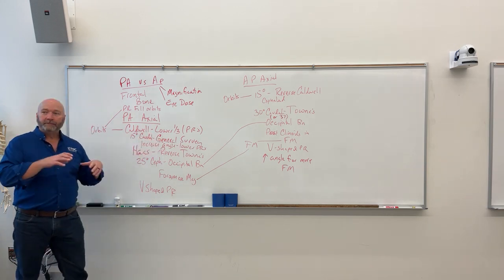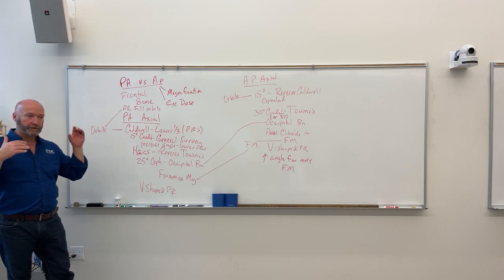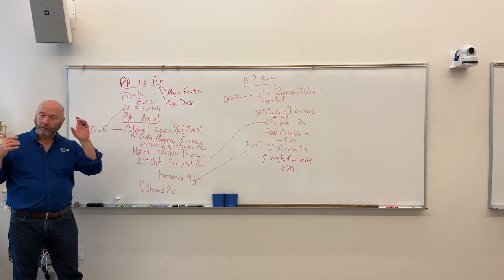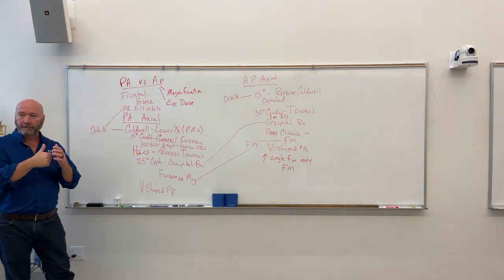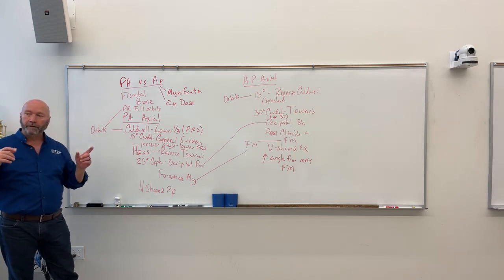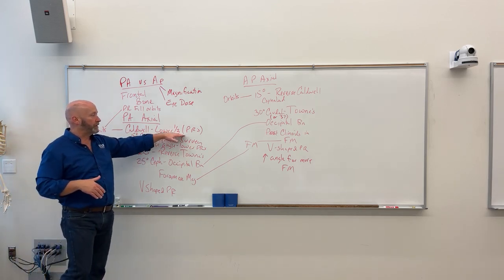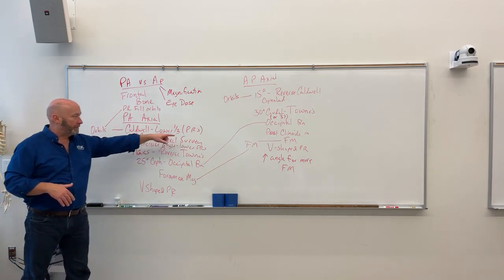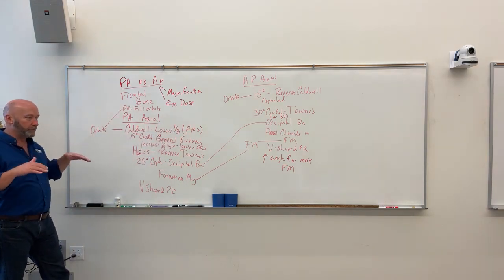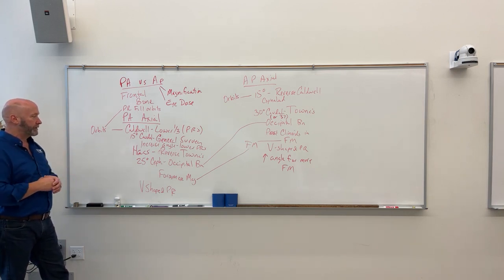And what that does is, because of the distance difference between the petrous ridges and the orbits, the petrous ridges are further back in the orbits. The orbits are going to be as close to the image receptor as possible. So with that 15-degree caudal angulation, the orbits don't move much, but the petrous ridges do, right? So it pushes them down into the lower third of the orbits. So that PR is petrous ridges. Petrous ridges lower to one third of the way through the orbits. So we get that more rounded appearance to the petrous ridges.